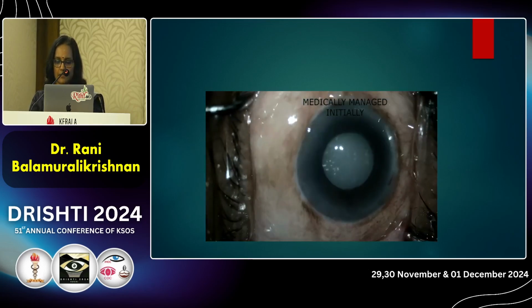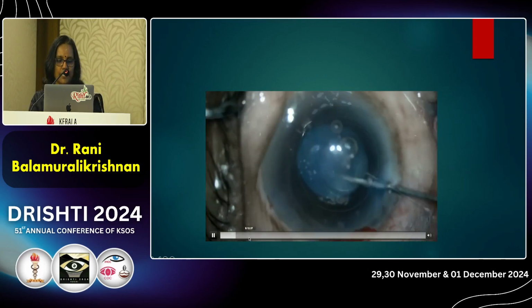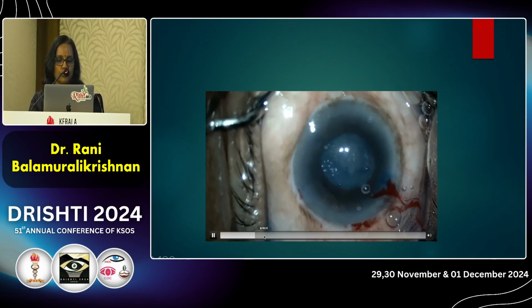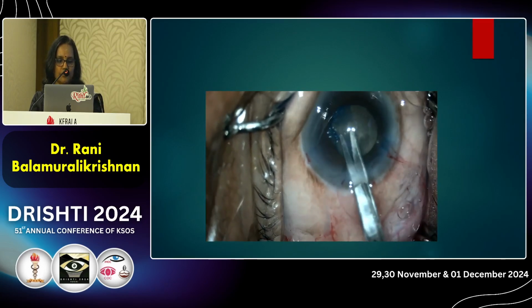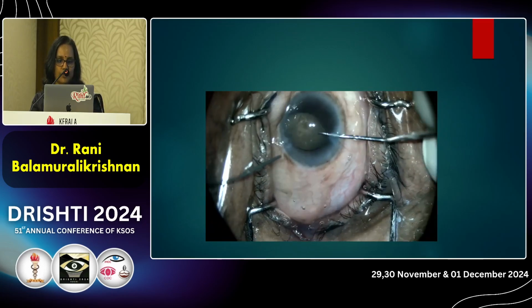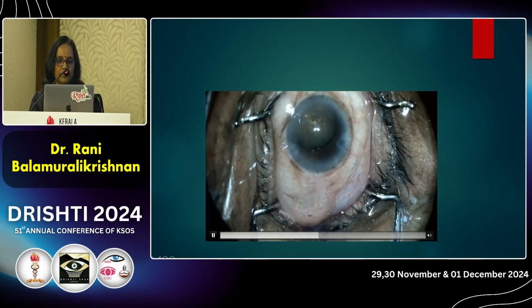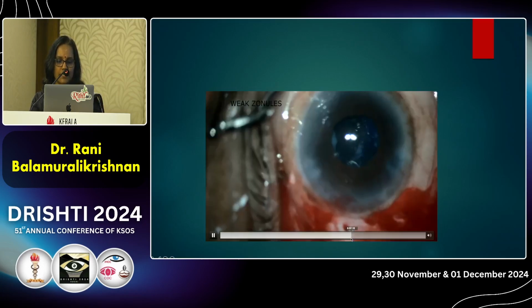We have planned a phacoemulsification for this patient, and once we proceed to anterior capsulotomy, you can see the zonules are too lax and it's difficult to perform the anterior capsulotomy. The capsule is cut with Vannas and the lens is delivered into the anterior chamber. When you deliver the lens into the anterior chamber, use 2 instruments so that the zonules are not further weakened. Convert into an SICS and deliver the lens.